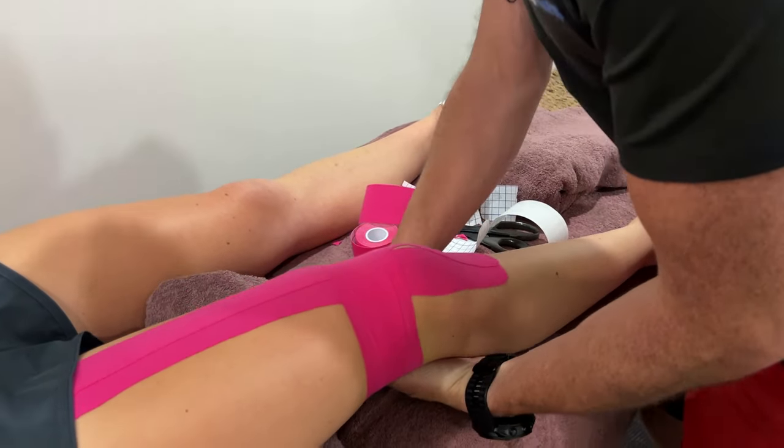When they stand up and load the knee, bending it, you'll feel this and this supporting those two tendons. She'll feel the tension from both tapes, and this quad tape is activating the quads — because you need the quads activated to help with the strengthening part. So there's your taping, I hope that helps. If you're wondering where to get kinesio tape, it's at our shop — you can get pink, blue, black, red, or even beige. Head to shop.physiorehab.com and you can get it all there.